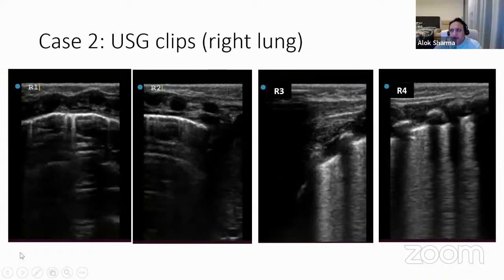It's unusual. If you have a linear probe that's nice and long, you should be able to cover the entire chest of an extremely preterm baby with even a single scan. So maybe when we talk on Tuesday, we can have a look at how you're doing it. Okay. Go for it, Mayank.